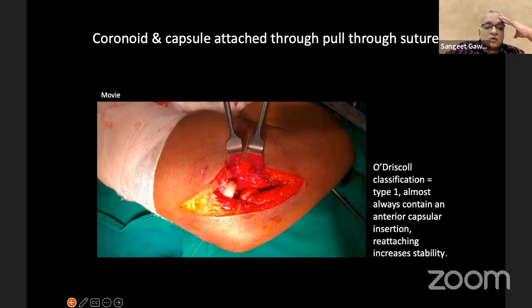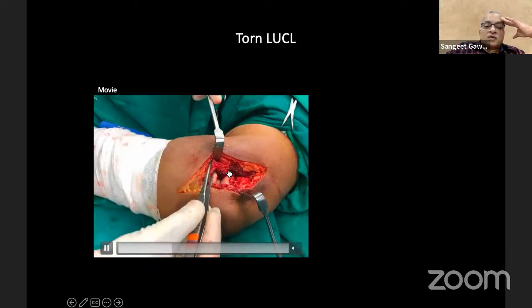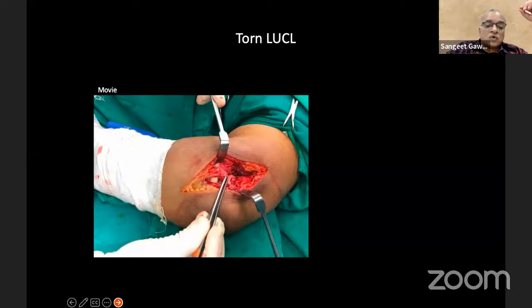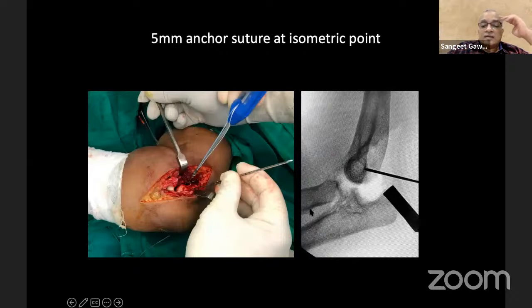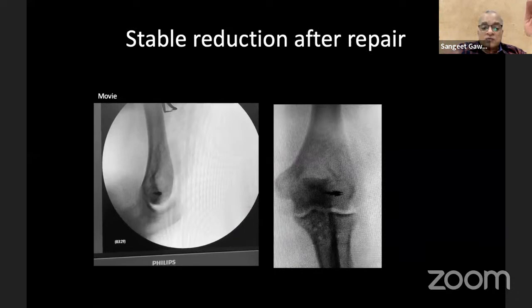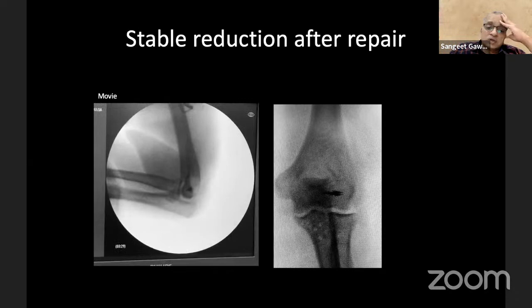And then we have to identify the lateral collateral ligament tear. So this is the lateral collateral ligament, which is a thick band which you cannot miss. And that has to go over the isometric point which you have identified. So at this stage, we are not suturing the pull-through suture. So first, put an anchor at the isometric point, take sutures. Because once you take a pull-through suture, then the anterior space reduces where you cannot work on. So do the coronoid and the capsular suturing at the last.